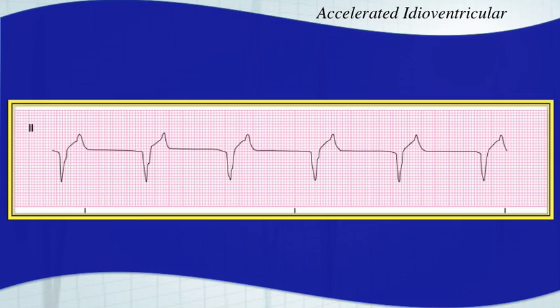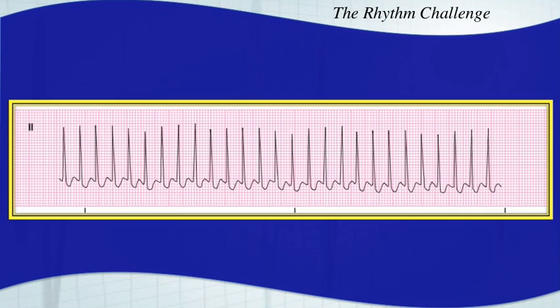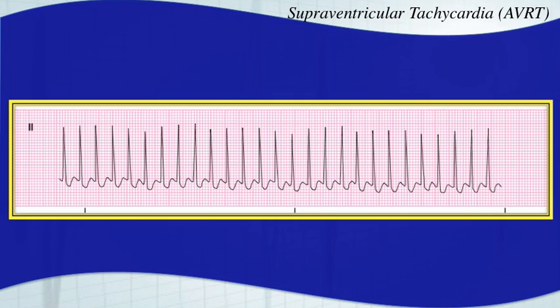You might note this one looks very fast. This is another SVT — this is AV nodal reentry tachycardia. This probably requires synchronized cardioversion. That is a fast rhythm right there. Your patient is not going to be appreciating it very much.